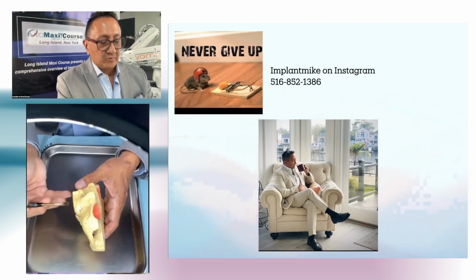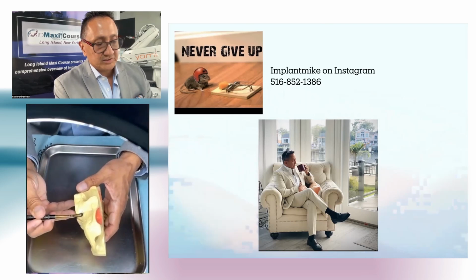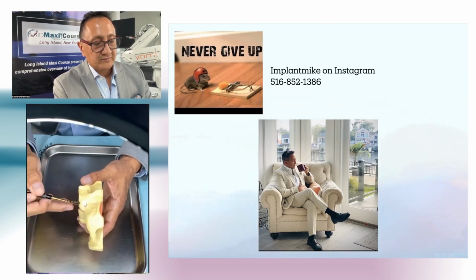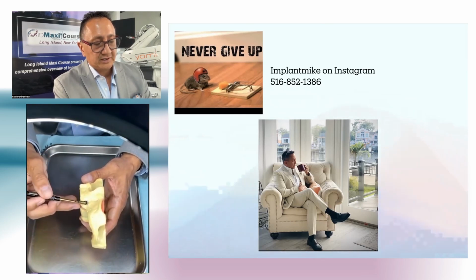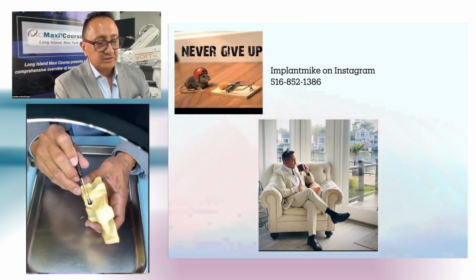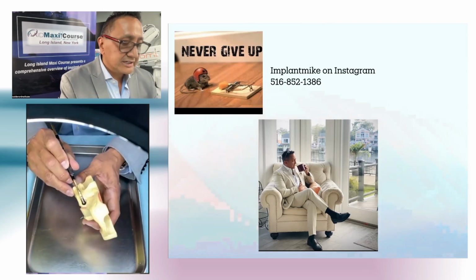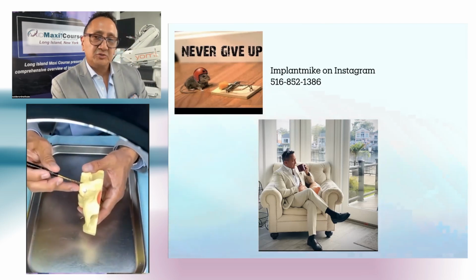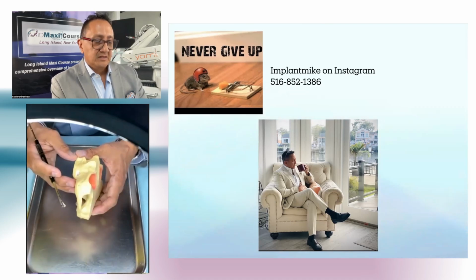Once we add bone there, we can actually measure this with this instrument. And if we measure it this way, you can see that every thick line is 5 millimeters. So that window from coronal to apical, or inferior to superior, is about 7 millimeters. Mesial distal, anterior posterior, it's about 11 millimeters. All right. So when that window, it doesn't matter how small the window is, you kind of want to make it wider.